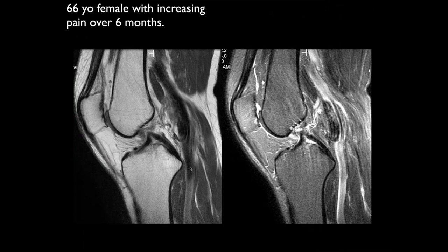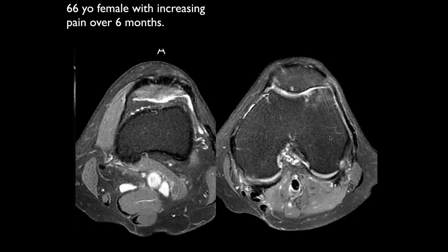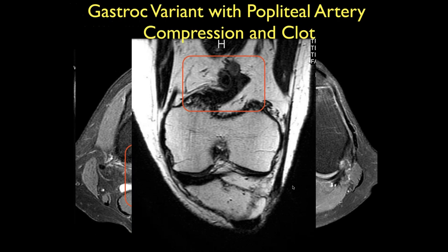Here's a 66-year-old female with increased pain over six months. We see a lot of abnormal signal by the vessels posteriorly, and a dark area within the artery. This patient had a gastrocnemius variant which kept compressing the artery, and they ended up with a clot in the artery, which produced ischemia in the leg and pain.